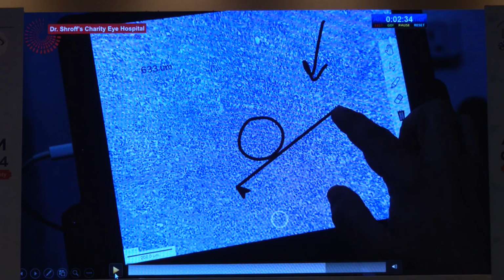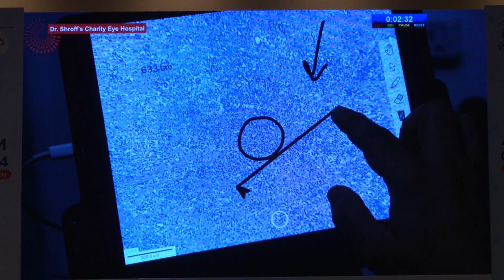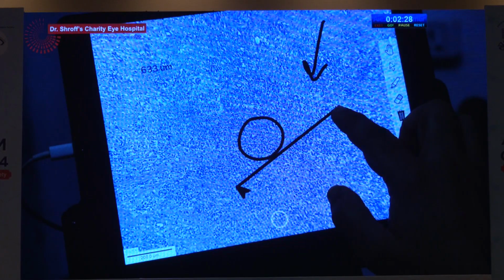So just pausing it here. There are two setups that we have. One is the biopsy coming in, and then we also offer digital pathology services for anybody who cannot send us biopsies. They can process the biopsies and send the readout through a digital system where we report it out.